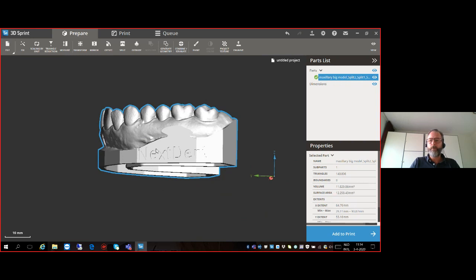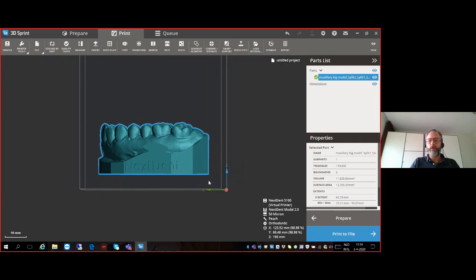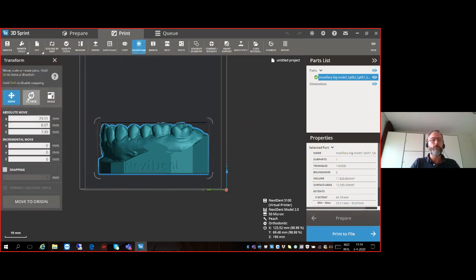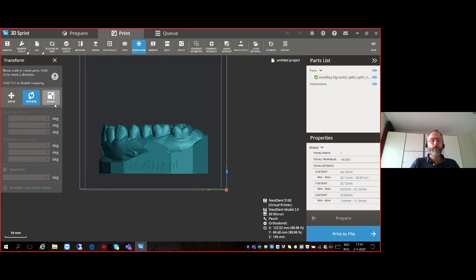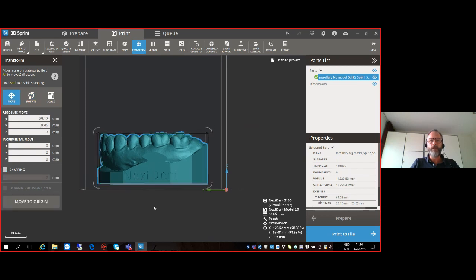Select the model — it becomes blue again — and we go back to Print. Because we took a part off the bottom, we want to make sure the model is as close to the platform as possible to save print time. This can be done using the Transform button. By clicking Move and Rotate, we can orientate the part in every direction. I just want to drag it down a little bit, so I use the cross with the left mouse button and bring it down to the platform.